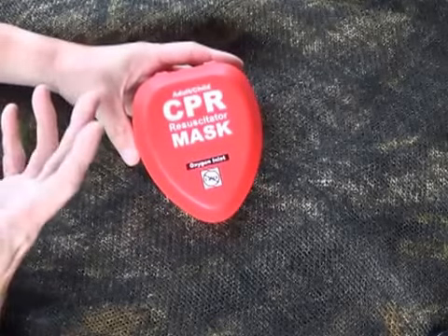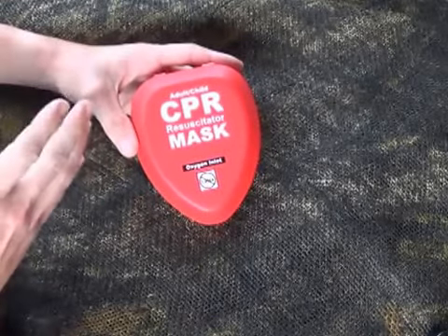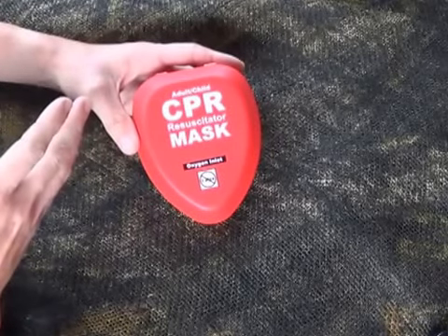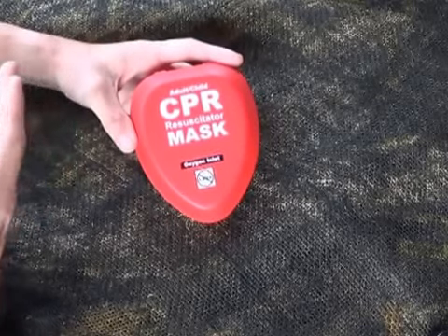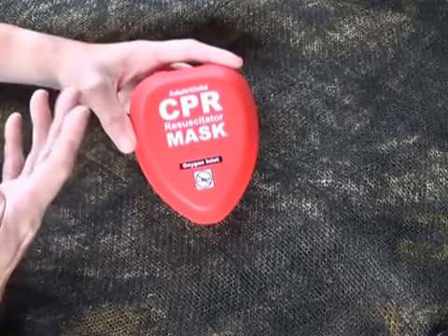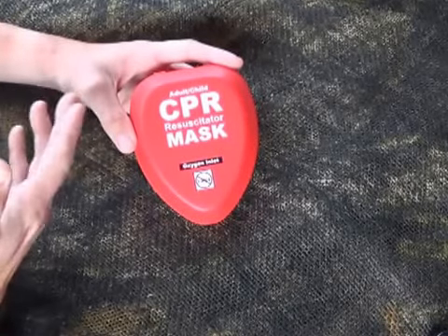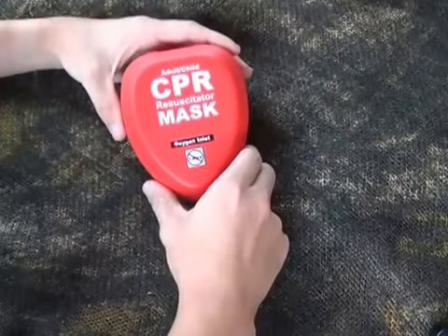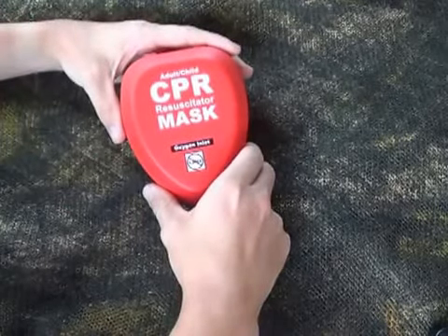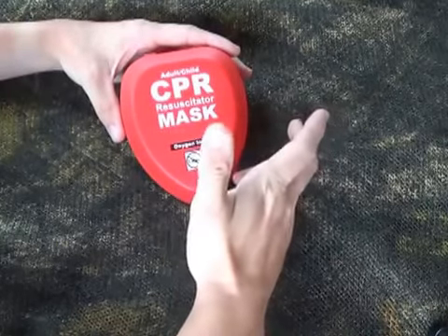The American Heart Association has gotten away from mouth-to-mouth for the layperson and bystander CPR. They've really gone to hands-only CPR. For CPR for the layperson, if you don't have healthcare training, you're doing compressions between 100 and 120 compressions a minute and you don't have to worry about doing mouth-to-mouth. For the healthcare provider, we are still teaching mouth-to-mouth along with compressions — it's a 30 to 2 ratio.